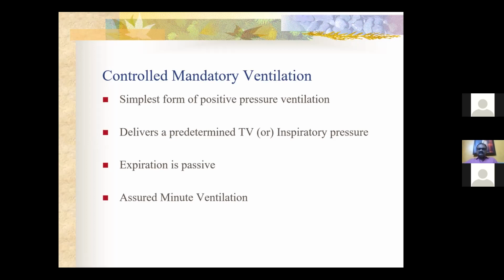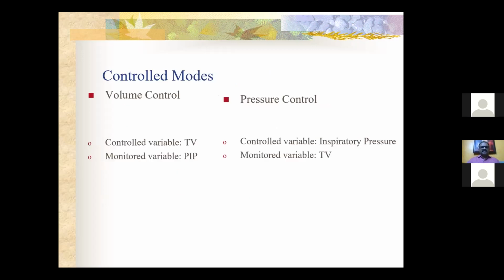Then the inspiration is basically given by the machine, and the expiration is a passive thing. One thing that we are sure of is an assured minute ventilation. Tidal volume times respiratory rate gives you the minute ventilation. So it gives an assured minute ventilation.